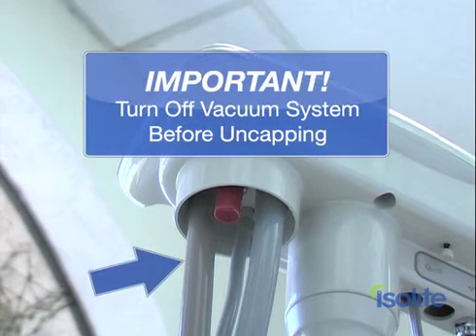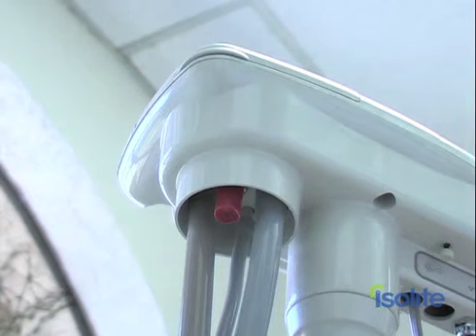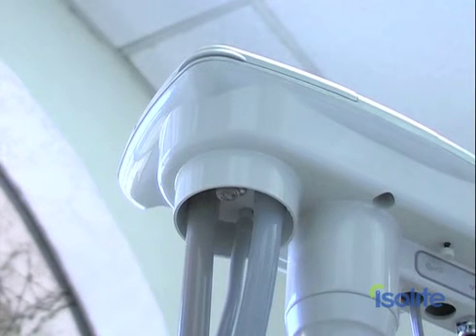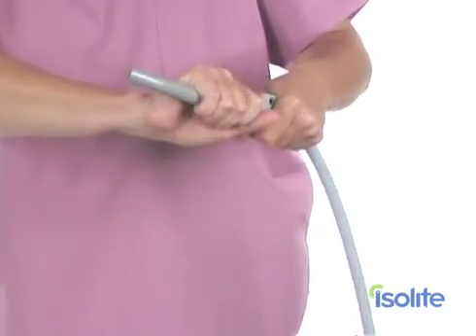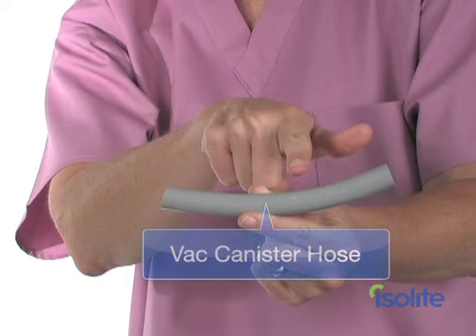Follow your existing suction from your saliva ejector or HVE back to the vacuum canister in your operatory. Locate the second HVE port on your unit. Place a towel on the floor directly beneath the port — we're going to be uncapping this, and you will usually have some fluid and debris coming out, so you want to make sure this doesn't leave a mess on the operatory floor. Sometimes it may appear as if there is a hard plug or shell or some hard material blocking the port — you're going to have to break through this. Remove the vacuum hose from the packaging, then remove the short vac canister hose from the Isolite power vacuum hose. You'll see that this is a short, trimmable piece of tubing that will connect your Isolite or Isodry system to your vac canister.